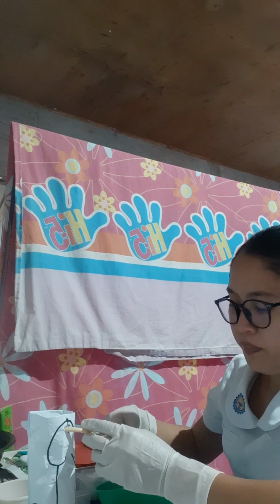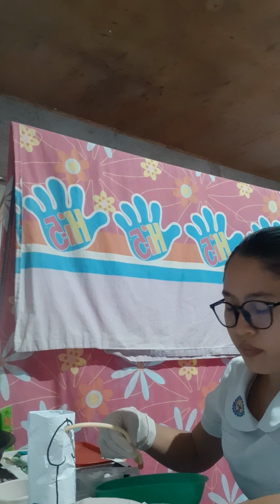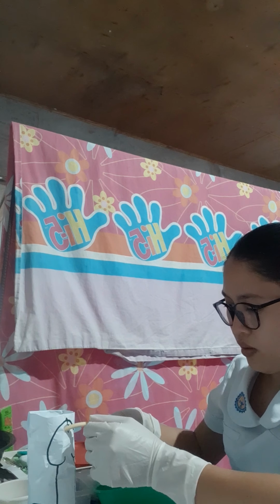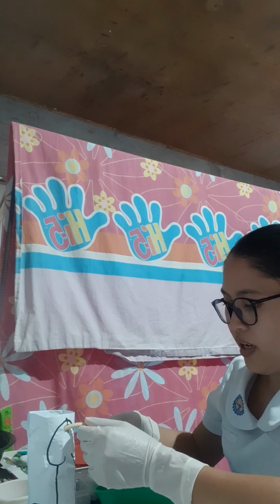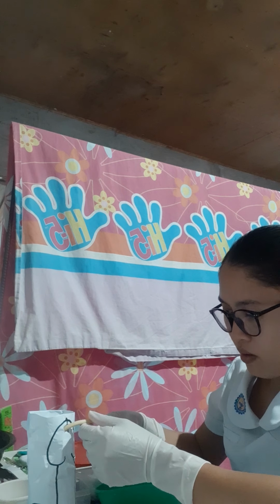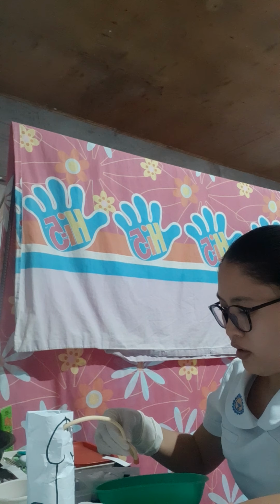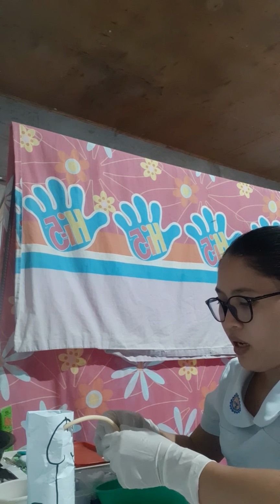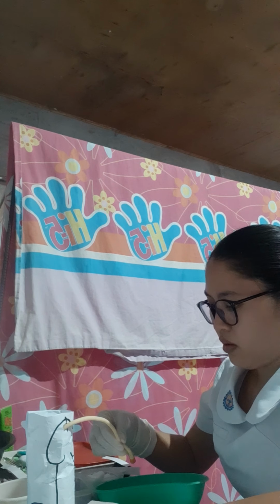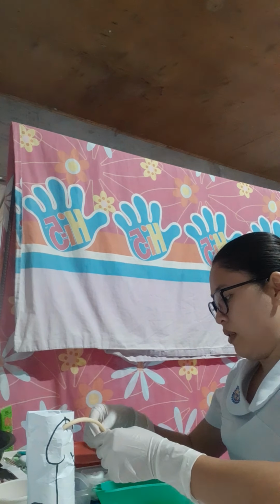Then after, next, collect a urine specimen as needed. So fill the cup to the desired level, 20 to 30 ml, by holding the end of the catheter in the dominant hand over the cup. With the dominant hand, pinch the catheter to stop if needed.